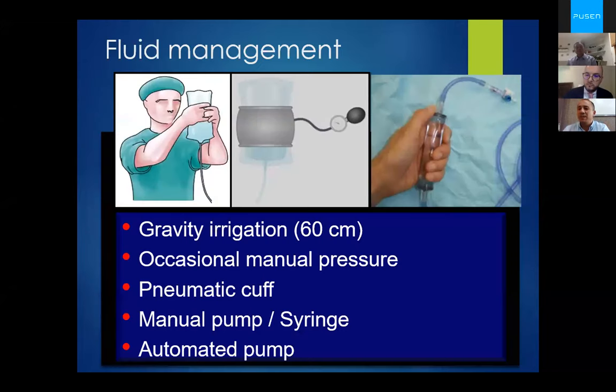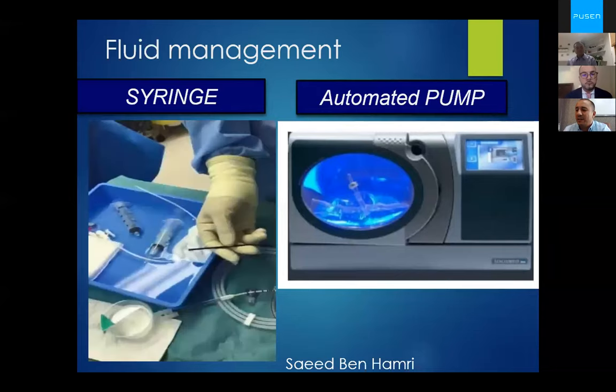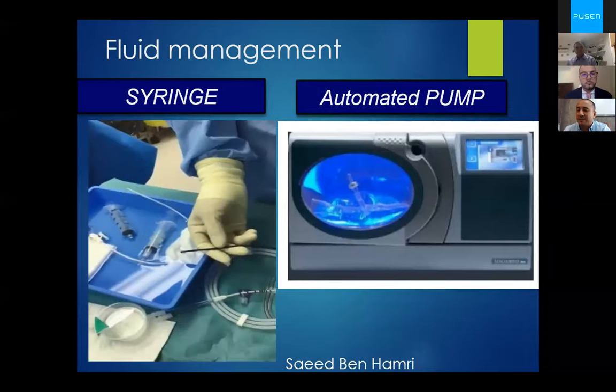Concerning fluid management, flexible ureteroscopy requires working with optimal flow and pressure irrigation for best visibility. There are different systems which exist to increase the flow of irrigation. We prefer and advise using gravity irrigation at 60 centimeters with occasional manual pressure, like this device, the Traxer Flow. The automated pump is adjusted to increase the infusion rate without significantly increasing the intrapelvic pressure.